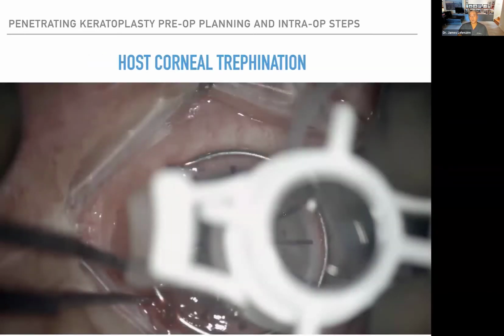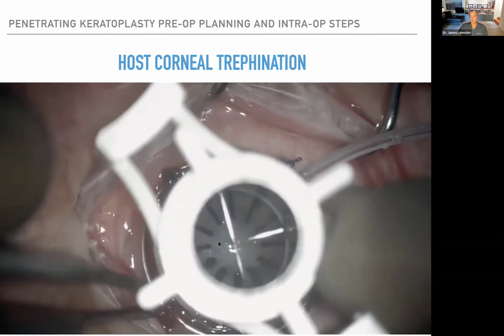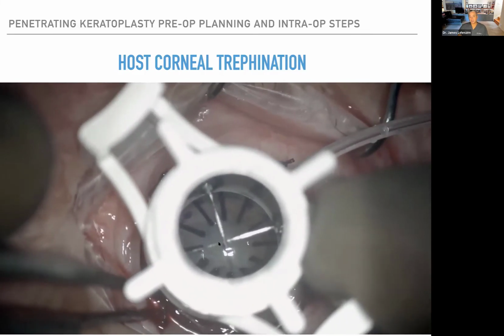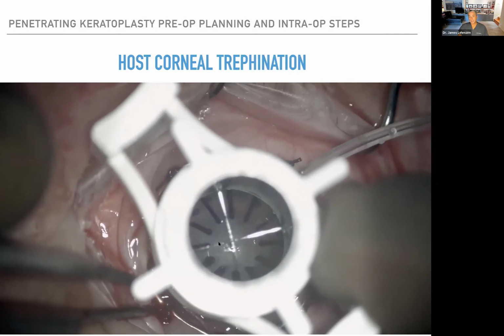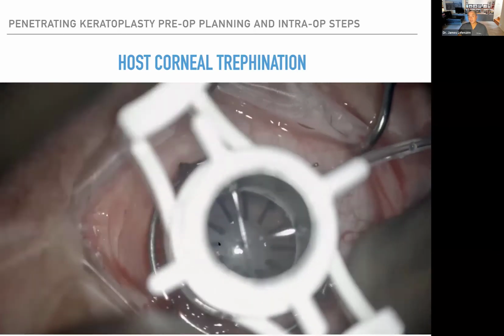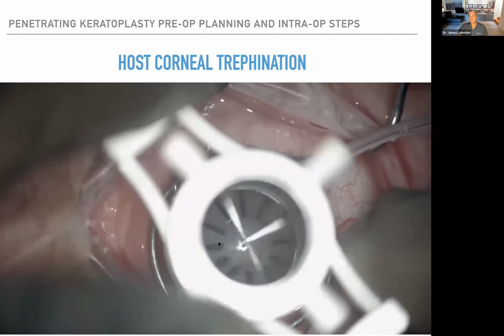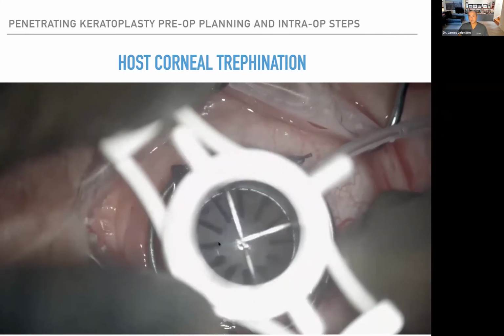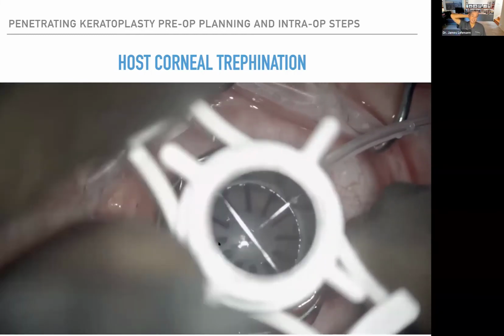So when you do the corneal host trephination, it takes 2 people. The tech or your assistant is going to man the trephine. This is a vacuum trephine, and you center it over that mark that you made in the center of the cornea. Then they get suction, and you can move it around a little bit and make sure that all those dots are incorporated. Then you rotate fast until you get to the epithelium, and then you do quarter turns, which do about 70 microns each. And I don't really like to enter the anterior chamber.